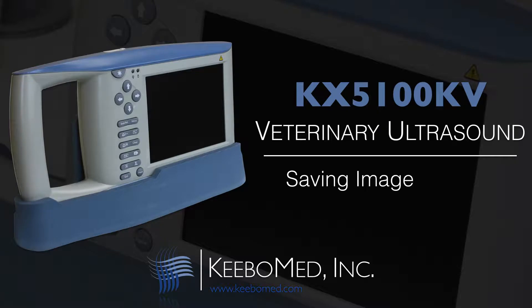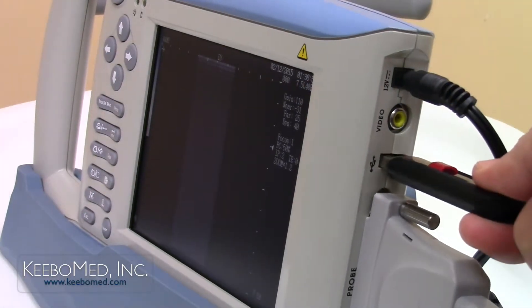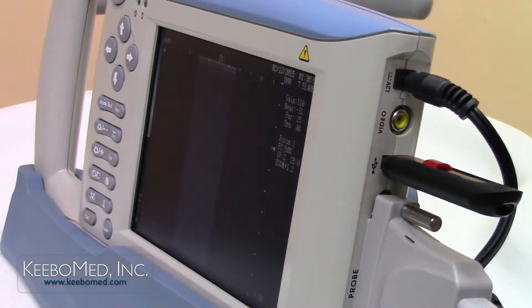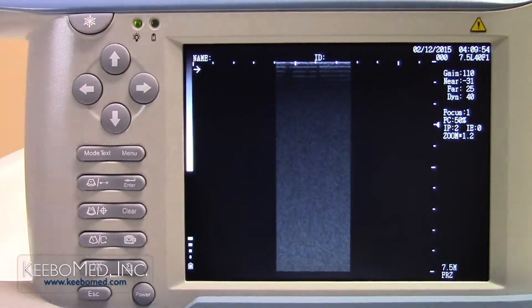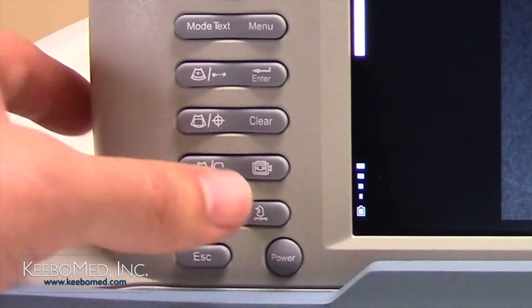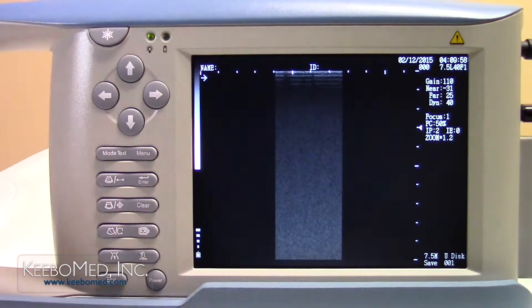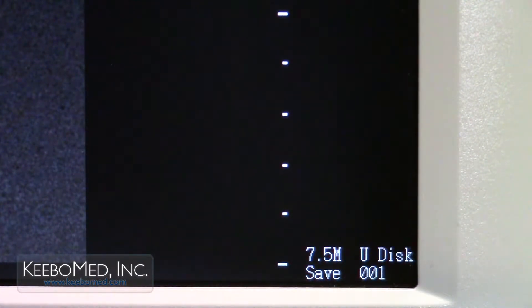Images can be saved directly to the USB drive by following these similar steps. Step 1. Insert a USB drive into the USB port on the side of the ultrasound. Step 2. Press the freeze key to freeze the image. The letters FRZ will appear on the bottom right corner of the screen. Step 3. Press the save key once. A save prompt will now appear on the bottom right corner of the screen. The word U-disk is also displayed.